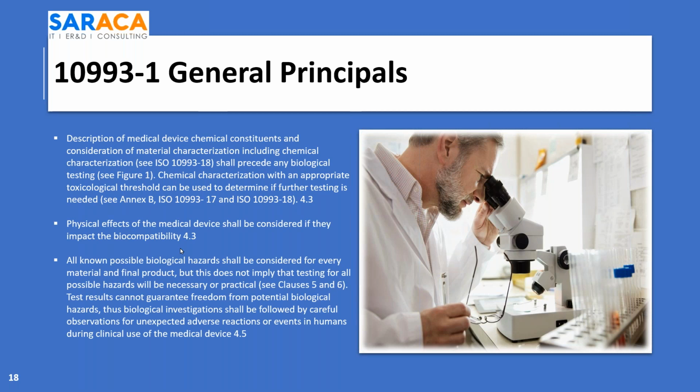The physical effects of the medical device shall be considered if they can impact the biocompatibility. All known biological hazards shall be considered for every material and final product, but this does not imply that testing for all possible hazards will be necessary or practical. Test results can't guarantee freedom from potential biological hazards. Thus, biological investigation shall be followed by careful observation for unexpected adverse reactions or events during clinical use of the medical device. Again, that's what they're going to expect from a biocompatibility standpoint.